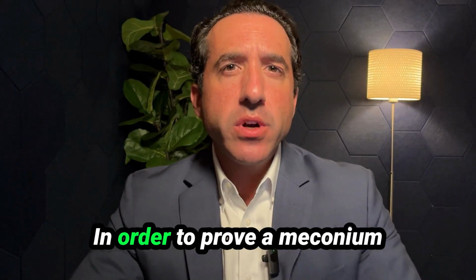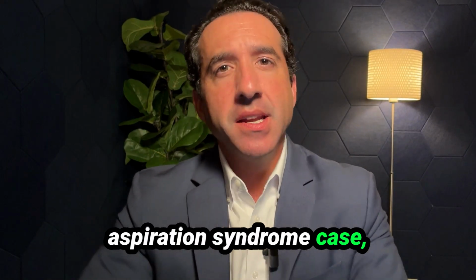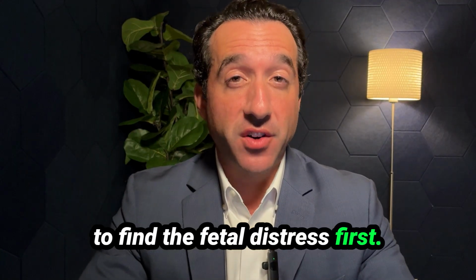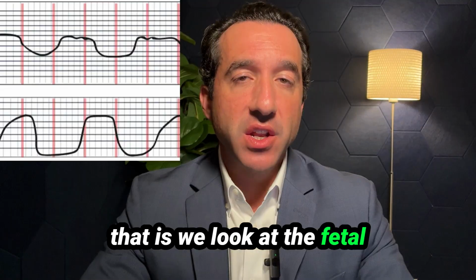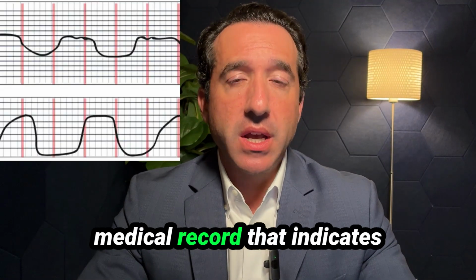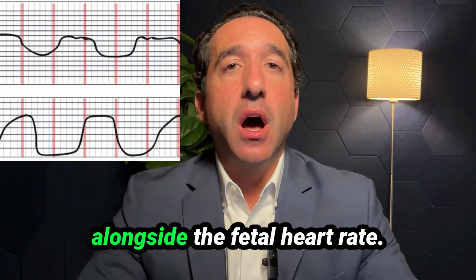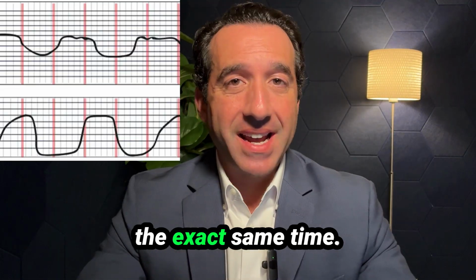Hi there. In order to prove a Meconium Aspiration Syndrome case, we birth injury lawyers have to find the fetal distress first. The way that we typically do that is we look at the fetal heart rate monitoring strips. This is a strip of paper in the medical record that indicates to us what the uterine contractions were doing alongside the fetal heart rate. They are measured at the exact same time.